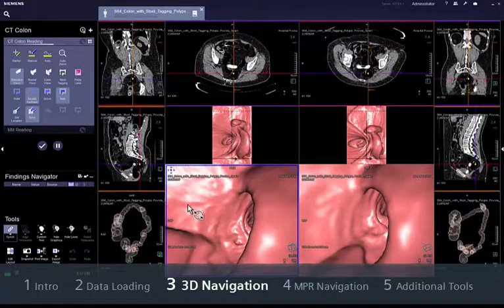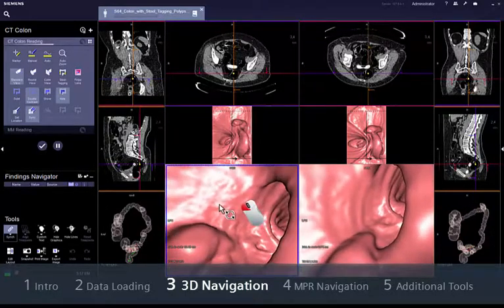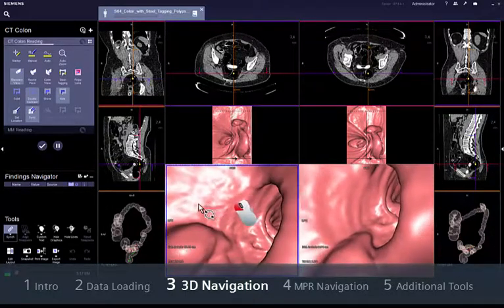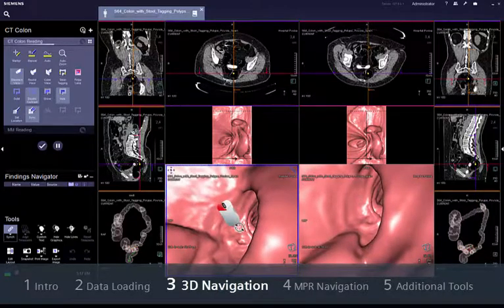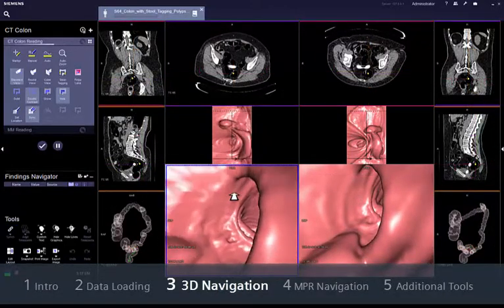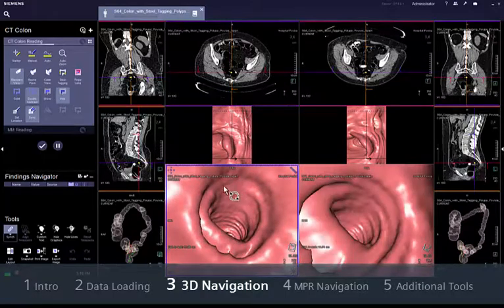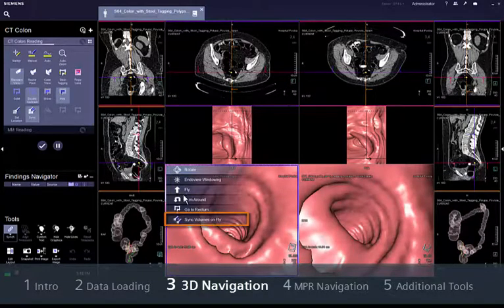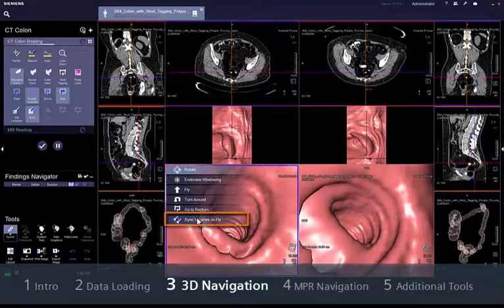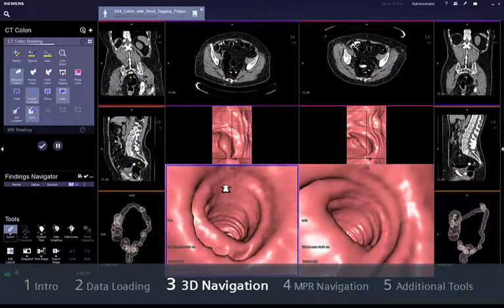3D rotation can be done by dragging the left mouse button. By default, when you stop the navigation, the corresponding segments of the prone data set are updated automatically. Select the option Sync Volumes on the Fly from the upper left corner menu if you want to have the volume synchronised during navigation.